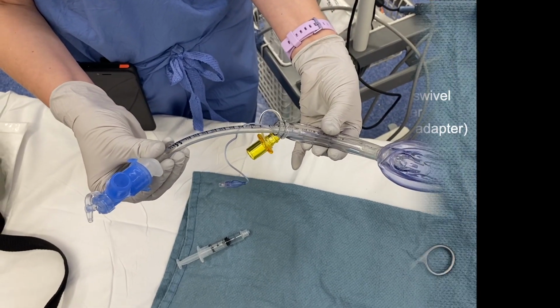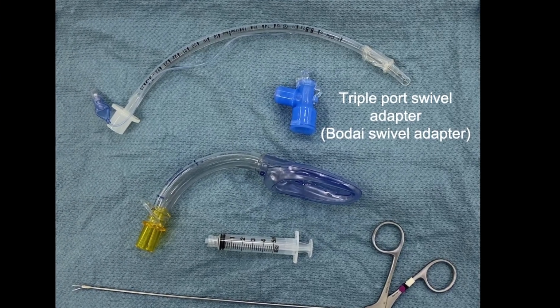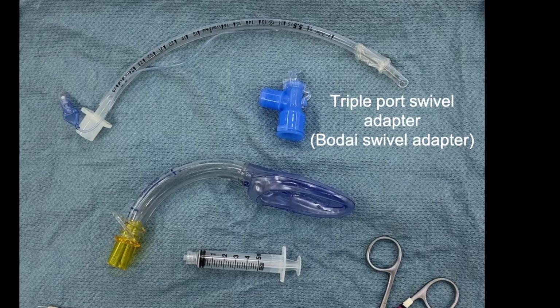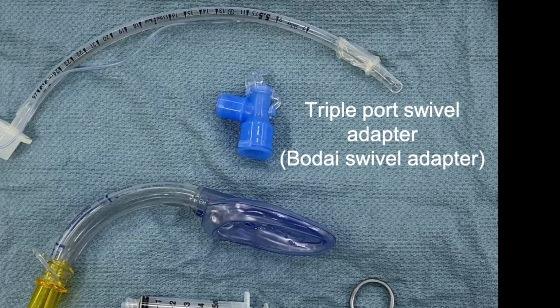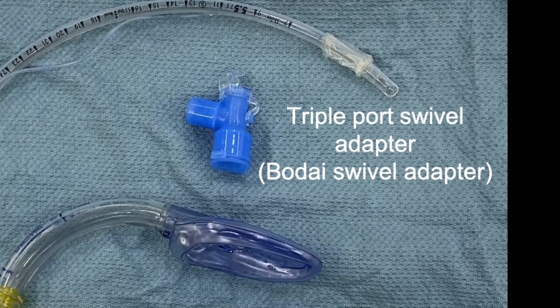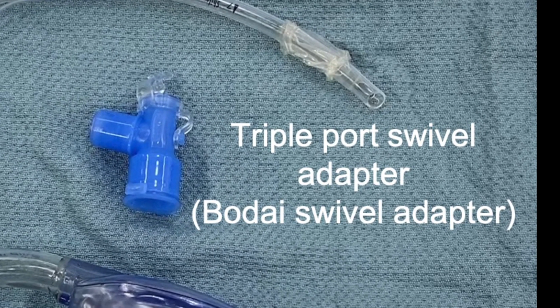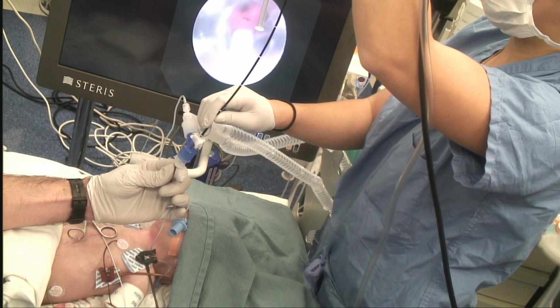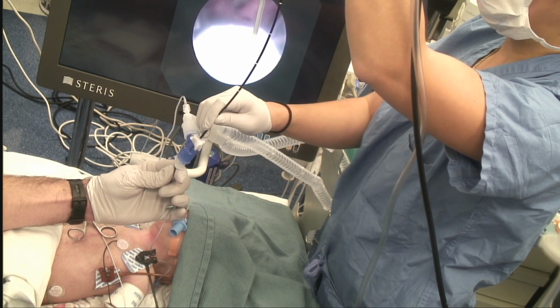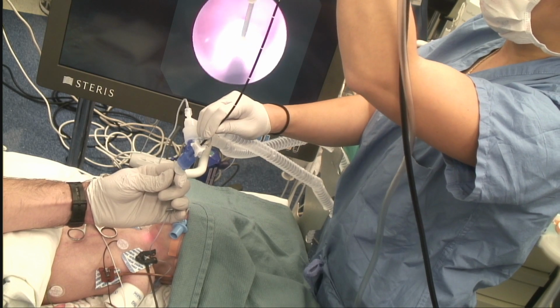A triple port swivel adapter is used to attach the tracheal tube and the circuit while also providing a port for the fiberscope. As the fiberscope ports on these adapters are designed for adult-sized fiberscopes, adding durable tape over the port with a pre-cut yet tight slit for the pediatric fiberscope will help prevent a large leak from the closed circuit. As used here, thicker tape is preferred over Tegaderm-like covering, as the latter will tend to stretch more easily and eventually result in a circuit leak.